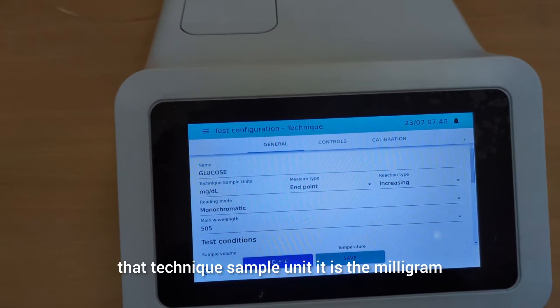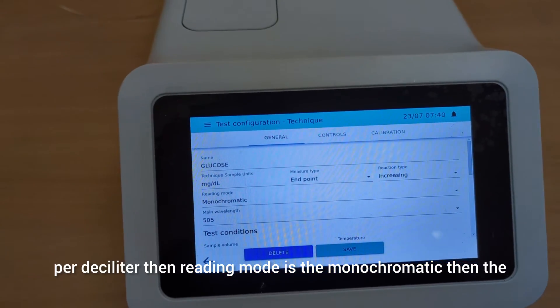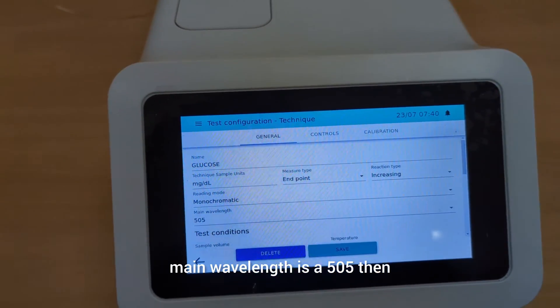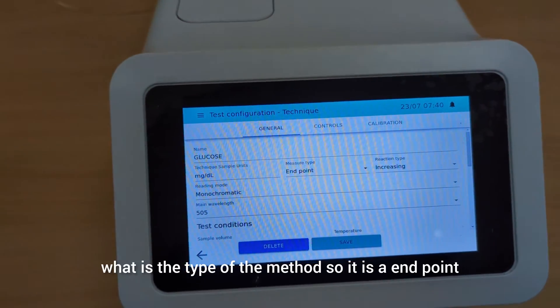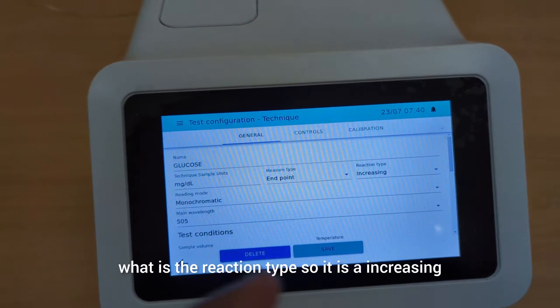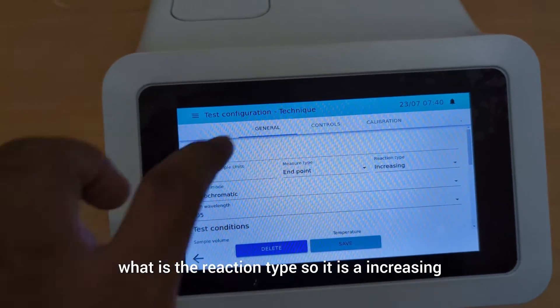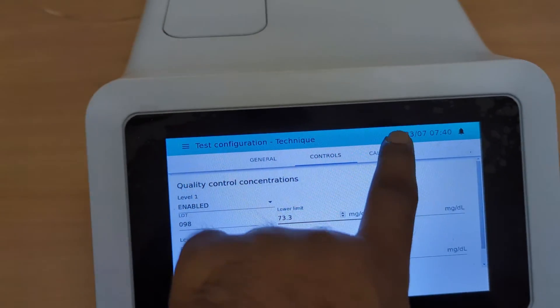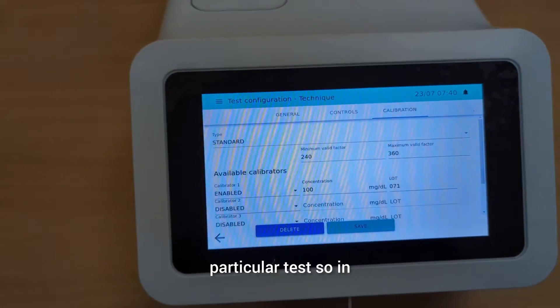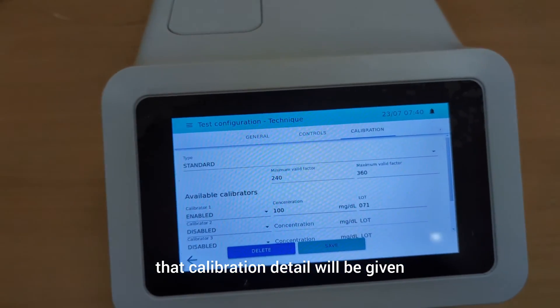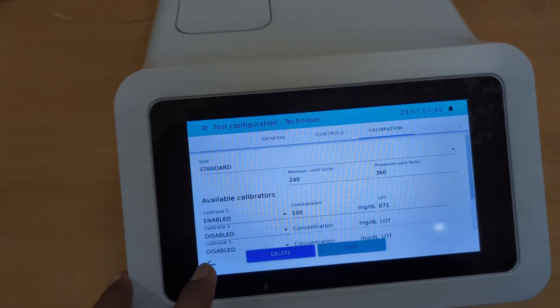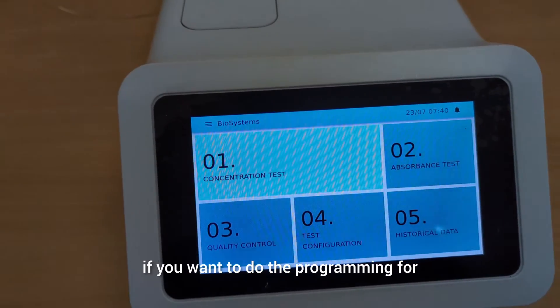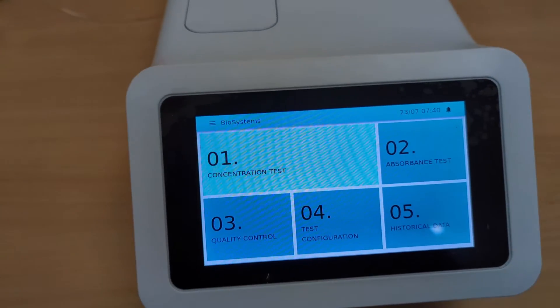This is the general setting for glucose. As you can see on the screen, the technique sample unit is milligram per deciliter, the reading mode is monochromatic, the main wavelength is 505 nm, the type of method is end point, and the reaction type is increasing. There is also the type of quality control, and at the last section, calibration details are given if you want to do calibration for this particular test.